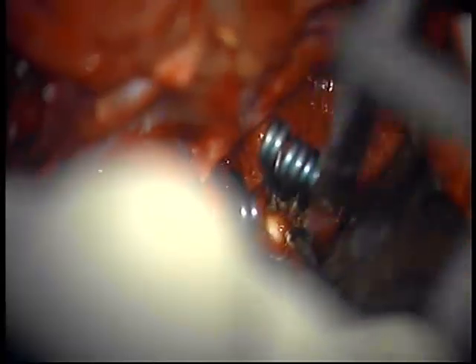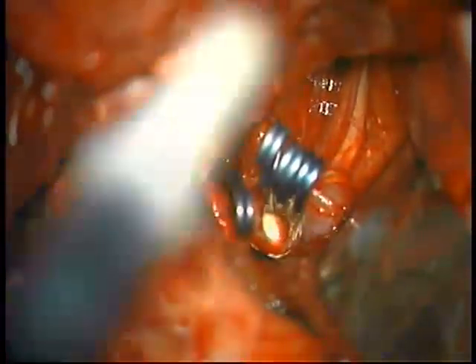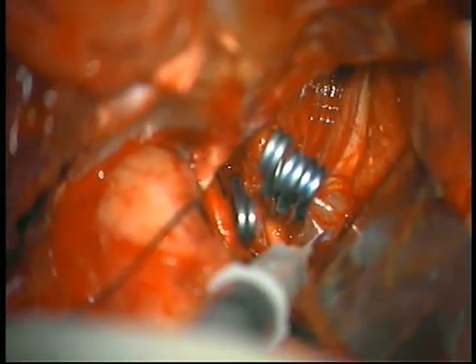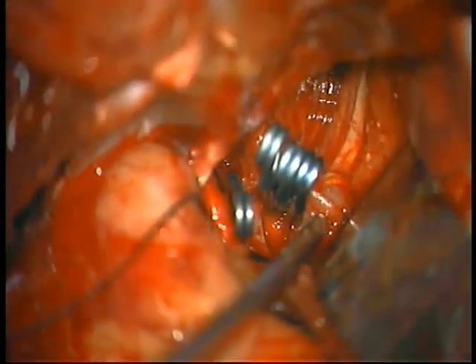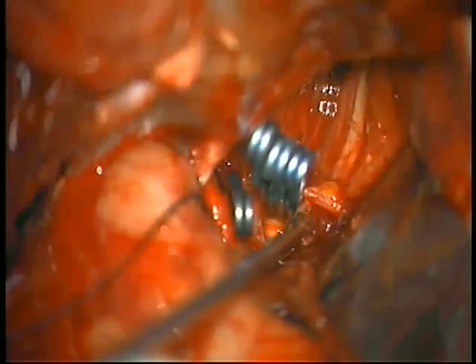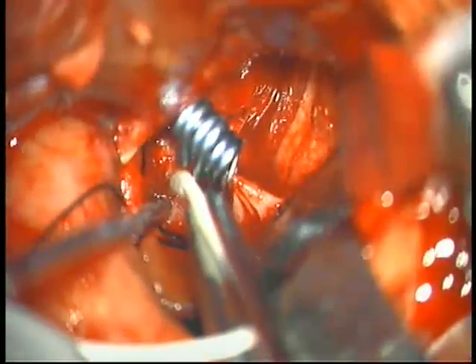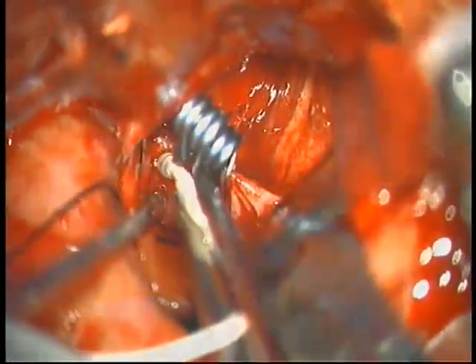and after that we puncture the dome of the aneurysm and apply negative pressure to be sure that no blood is coming from the dome of the aneurysm. Finally, we use the transcranial Doppler to confirm the patency of the internal carotid artery.